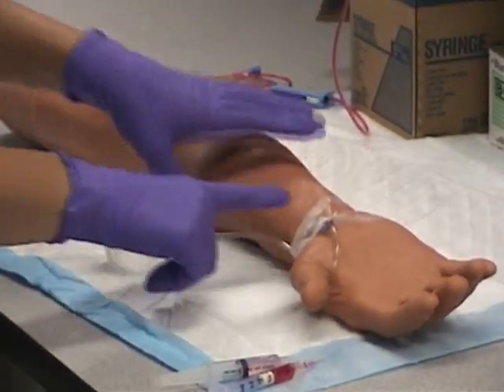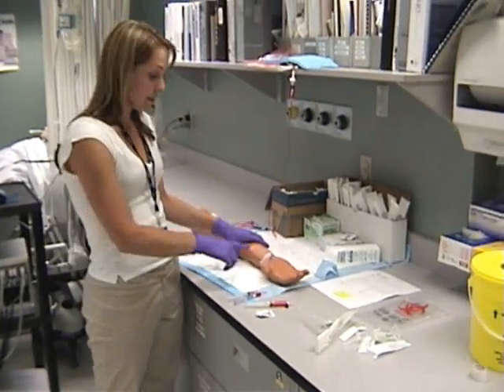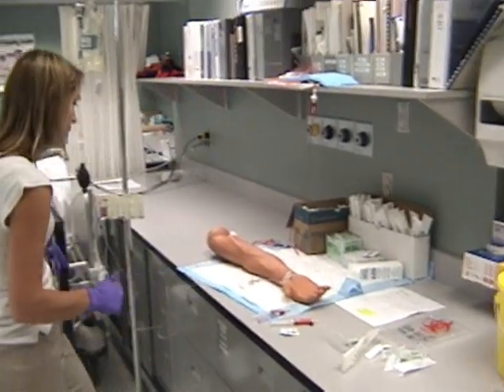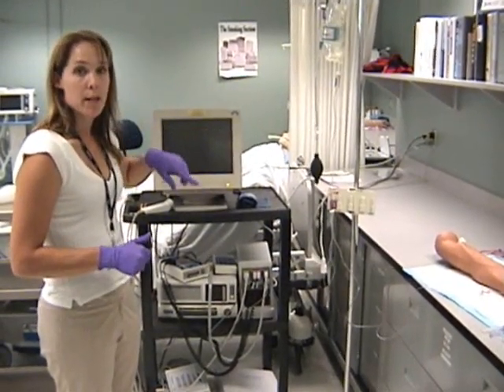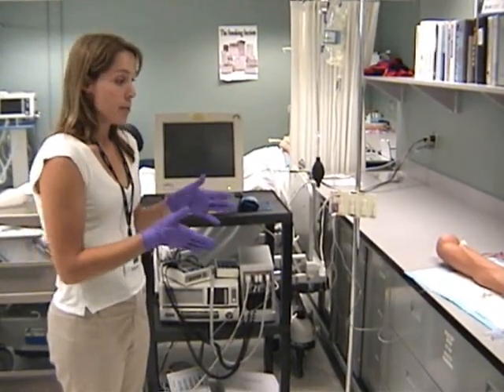Once that's done, check the site to make sure it looks okay — that there are no complications such as leaking of blood — and make sure there's good perfusion in the hand. Then go back to your patient monitor, take it off silent, and re-arm the alarm. Make sure you have a good arterial blood pressure waveform and that the pressure reading is about the same as when you started.